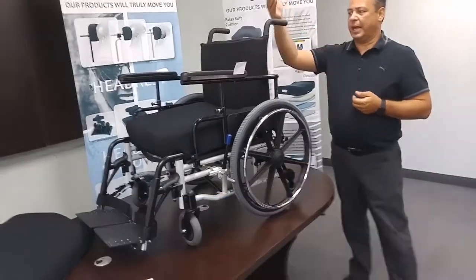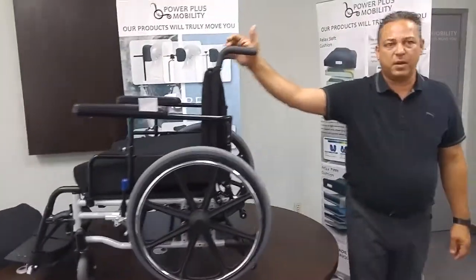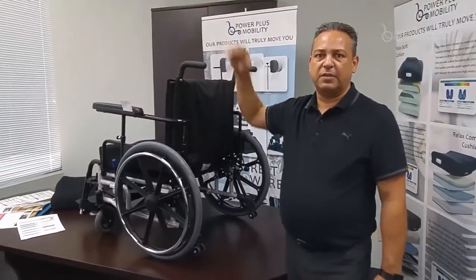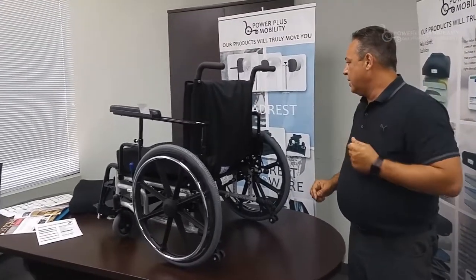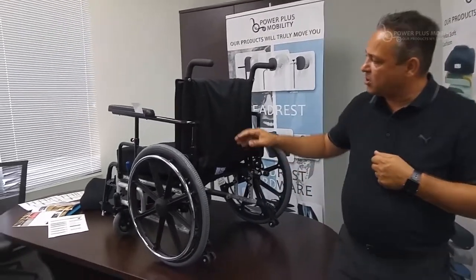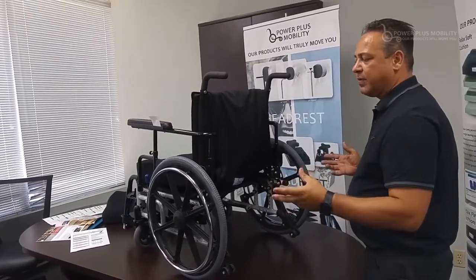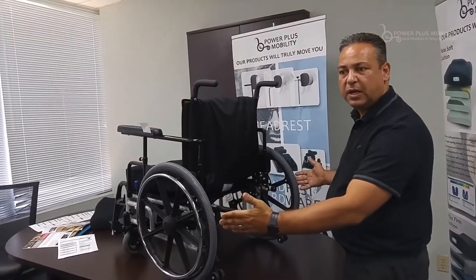Rolling over to the back canes, our standard height is 14 to 21 inches. If you need to get any taller than that, just let us know and we will customize that for you. The arms are also wrap-around arms. Weight is always an issue — the total weight of the chair, seat-to-floor heights, and also the overall width of the chair can always be challenging in old wartime homes and tight doorways.